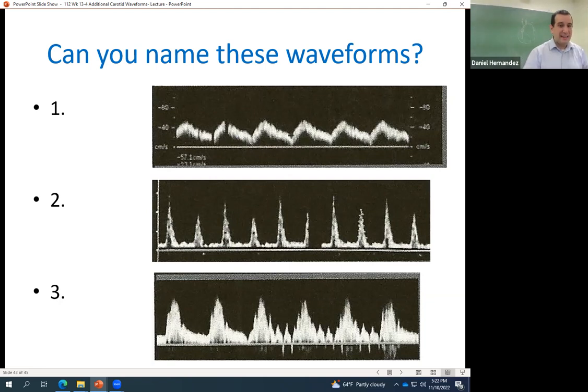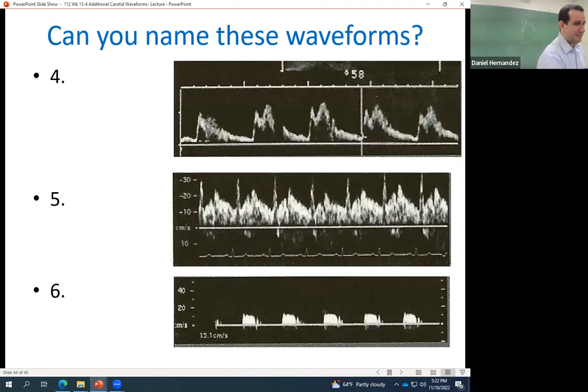So maybe they didn't see the ICA. They couldn't find it because it's occluded. They just see this one vessel. They're pretty sure it's the ECA, but they Doppler it and it looks like an ICA. Oh God, it looks like an ICA, but I'm pretty sure it's ECA. They temporal tapped just to prove that it was the ECA. In this case, this was internalization of that ECA.